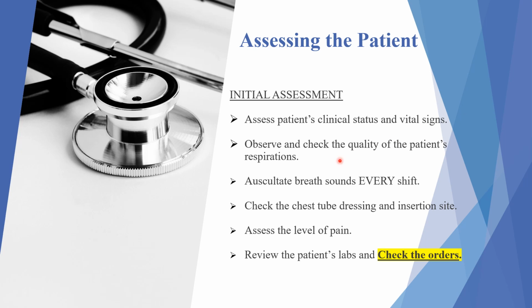Auscultation. We want to make sure we're listening to the lung sounds. Very important that we listen to those lung sounds, especially those with chest tubes. It can indicate whether or not we're getting better, staying the same, or getting worse. Do we have breath sounds around that chest tube side or on the affected side? Did we have good lung sounds yesterday and today we don't have any lung sounds? I know this says to check your breath sounds every shift, but in a critical care setting, you're probably going to be doing this every 2 to 4 hours. Realistically, we should be listening to the lungs every couple of hours.